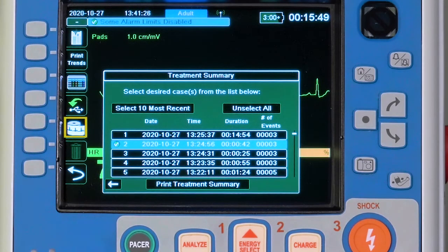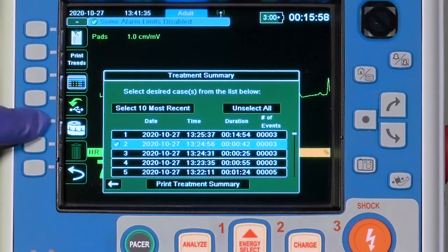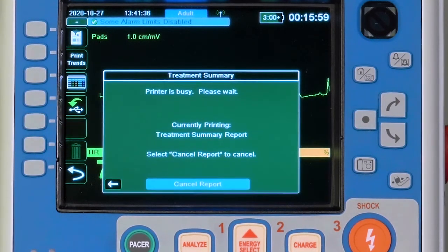When the case is selected, the Case Push icon temporarily changes to a Print icon to provide a shortcut to print the selected summary. Printing can be halted at any time during the Treatment Summary printout.